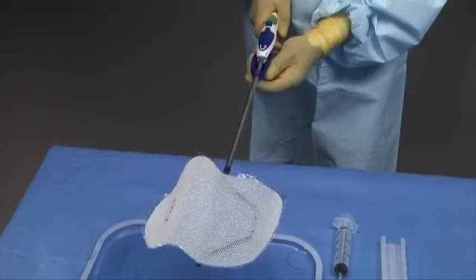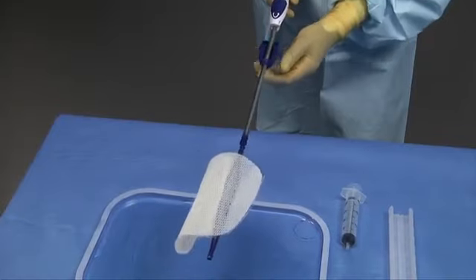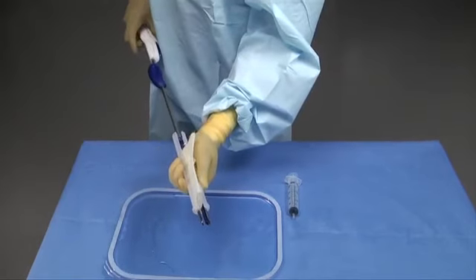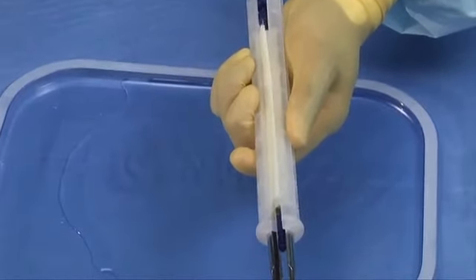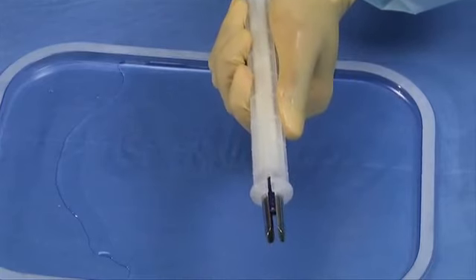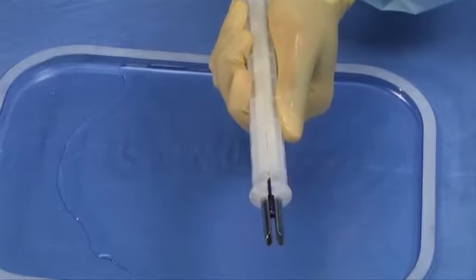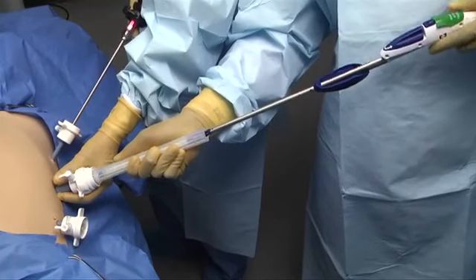Close the deployment frame by pushing the deployment lever forward until it stops. Open the furling tool and place the prepared mesh and deployment frame into the furling tool. The mesh is rolled by rotating the handle of the AccuMesh articulating mesh positioning system and simultaneously closing the furling tool with hand pressure to achieve a tight roll of the mesh prior to insertion into the access port and abdominal cavity.